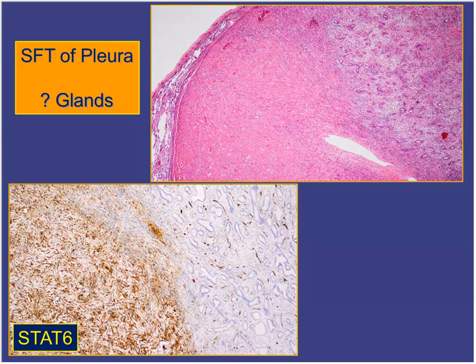The question was whether this is an adenocarcinoma there, or a malignant mesothelioma involved in there. And of course, in solitary fibrous tumors, the marker for that is STAT6, which we're going to shortly discuss. But you can see that those glandular structures in the lower right are negative.